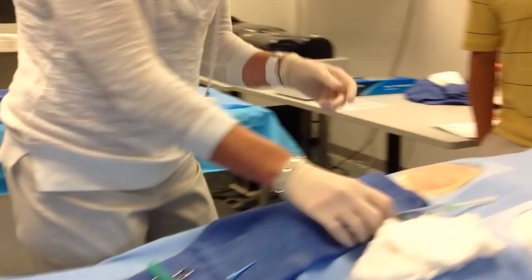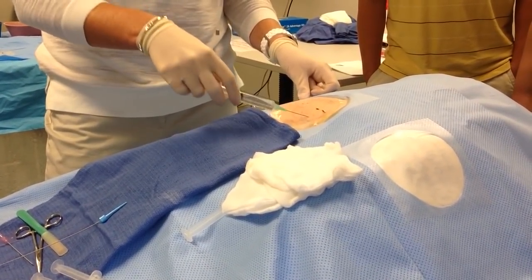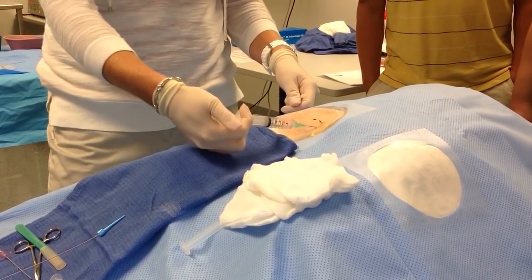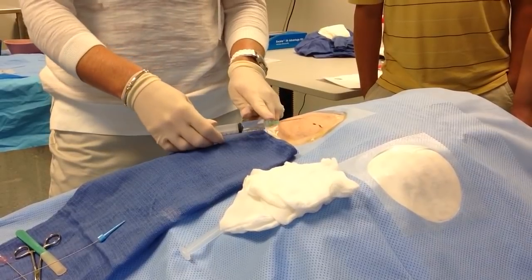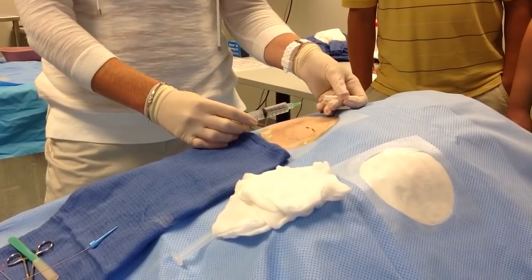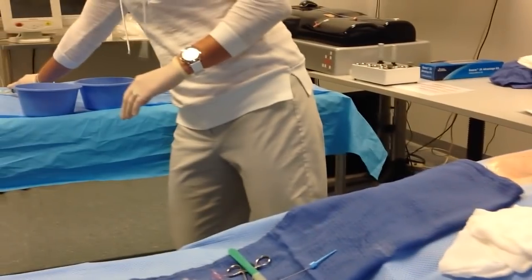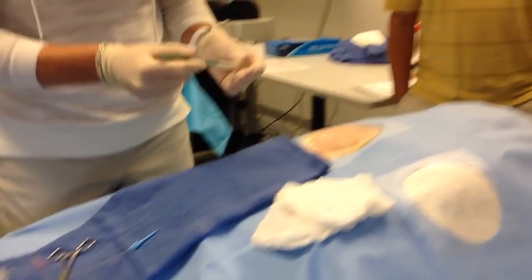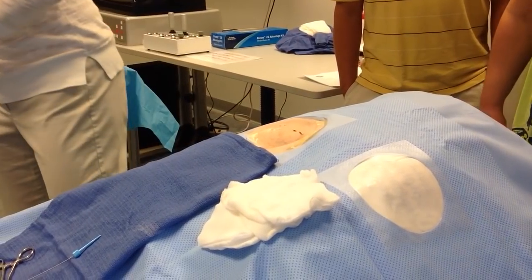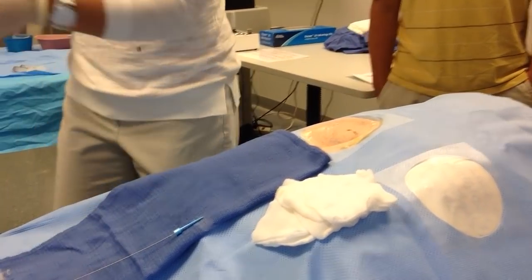So then the physician comes in, they're going to numb the groin. And they'll go in a wheel around the site here, if they're nice. Some places start with a smaller needle to go right under the skin, and some places don't. So they numb the groin, and then we make a nick. We already have a nick there. And if they want to spread it with the hemostats.